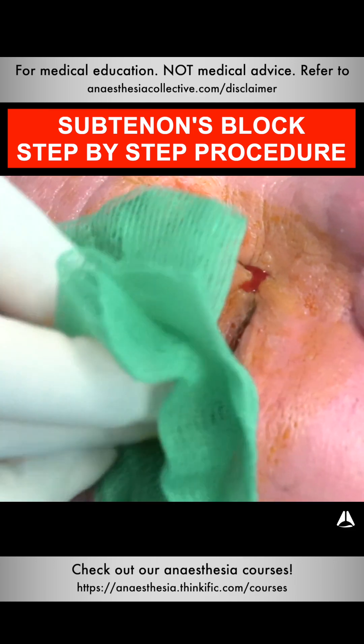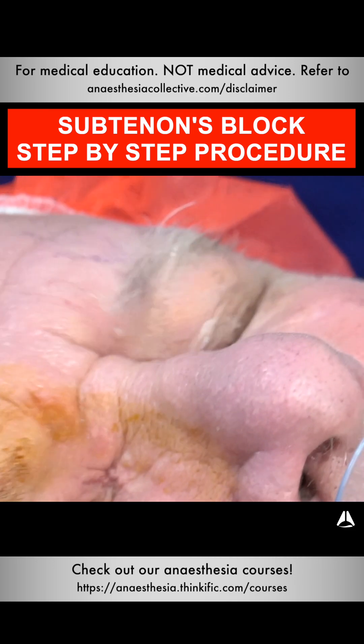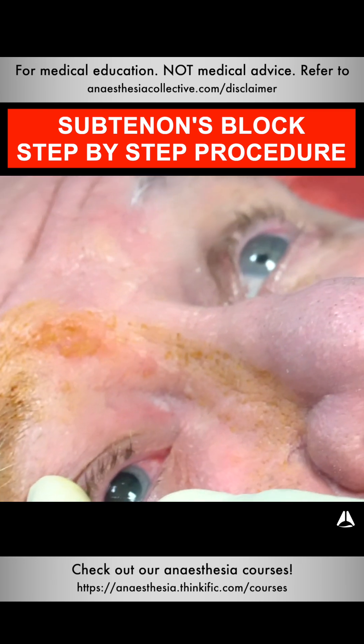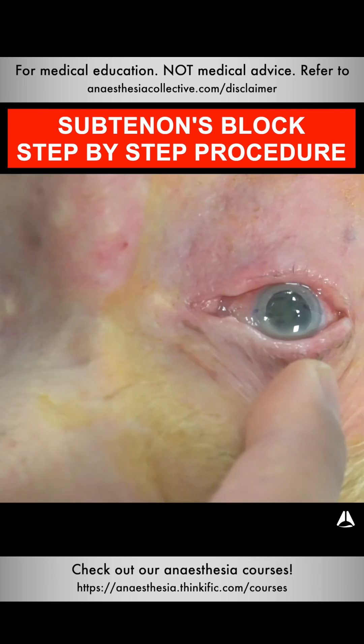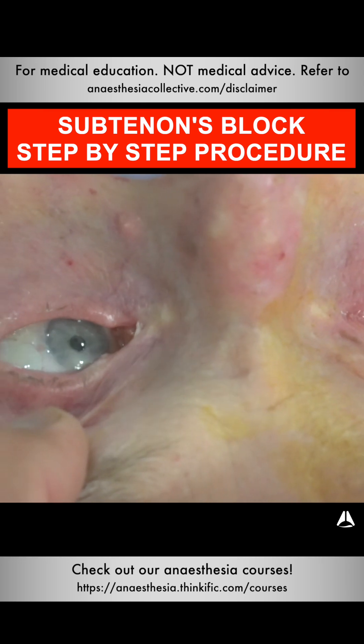And then out it comes. Close your eyes — that's great. I just put some pressure medially. The fact that one eye is slightly sluggish means this should be working well. Notice that the left has no movement, so that means that it's working really well. And then the rightward movement.